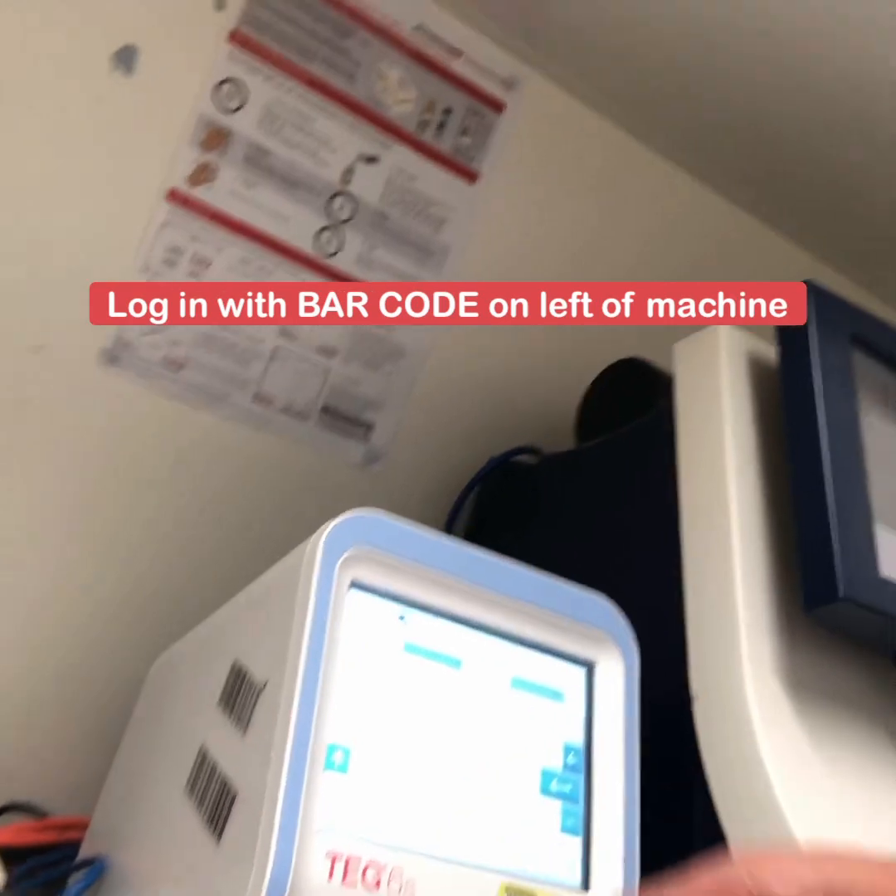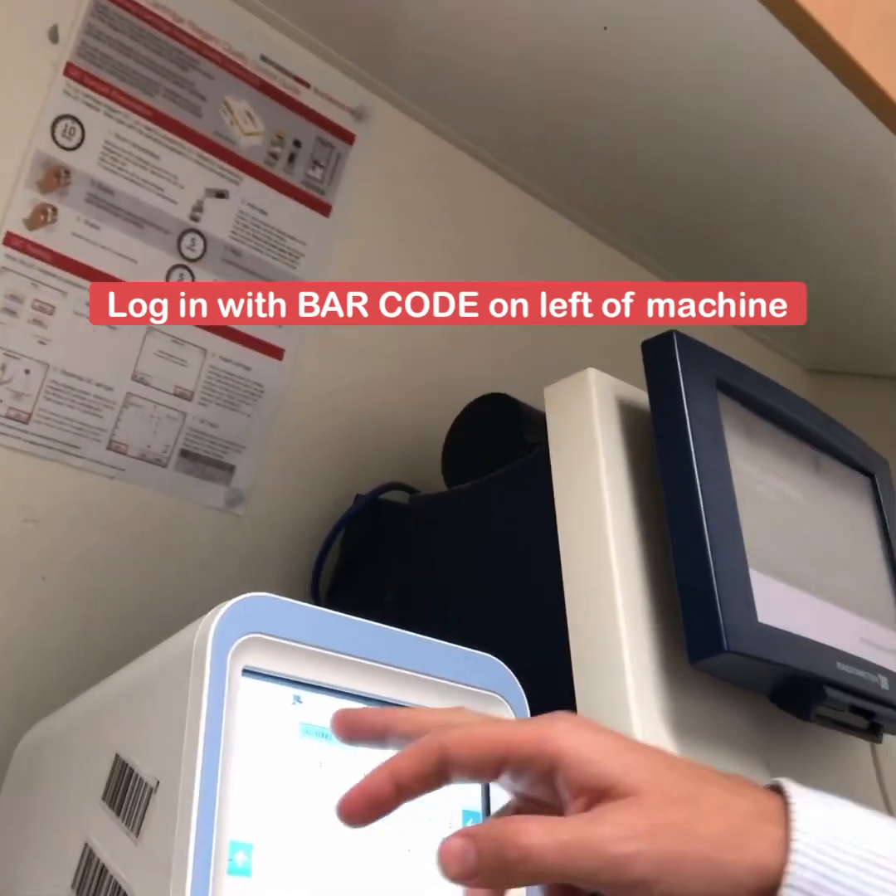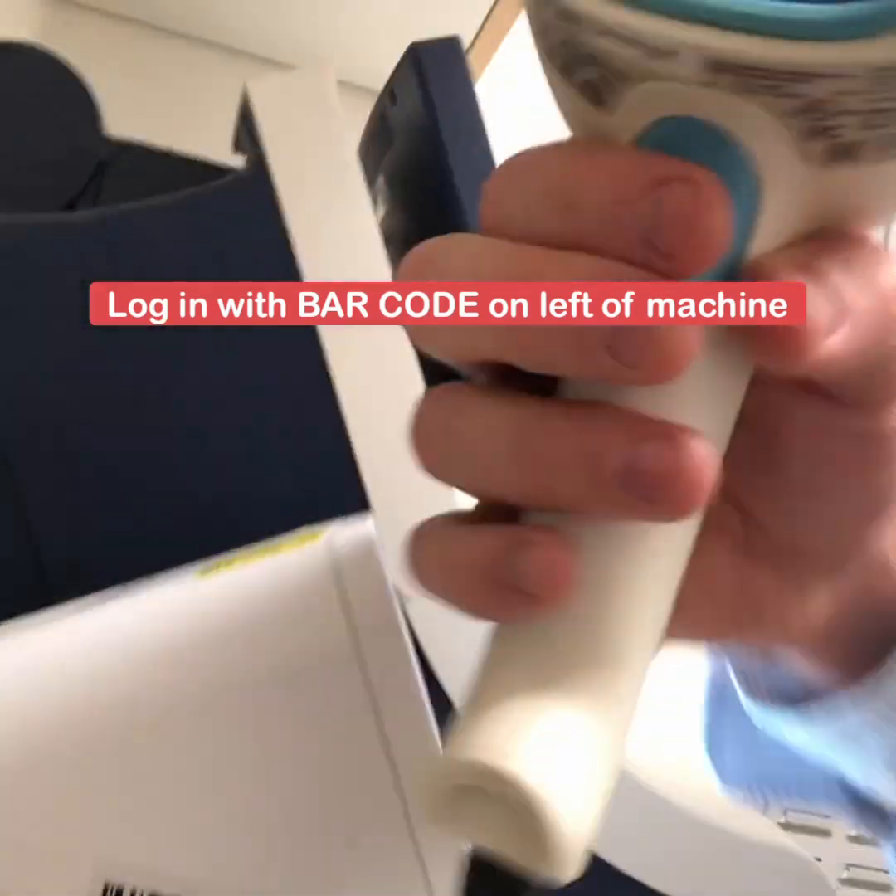First thing to do is turn the machine on — touch the screen with your finger like this — and you need to log in. When you log in, you use the barcodes on the side of the machine and this scanner.